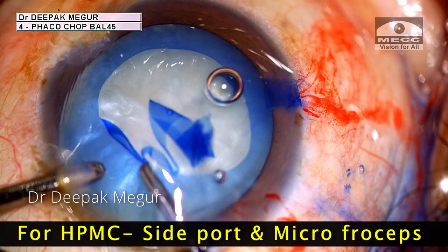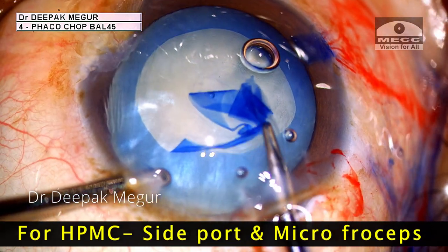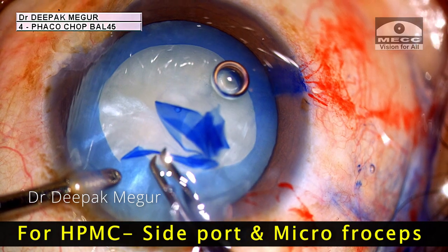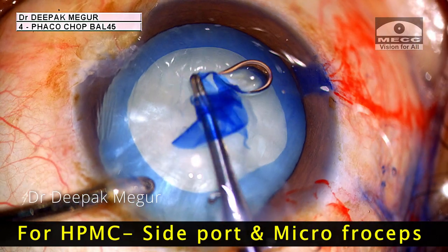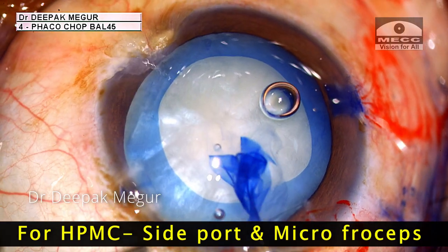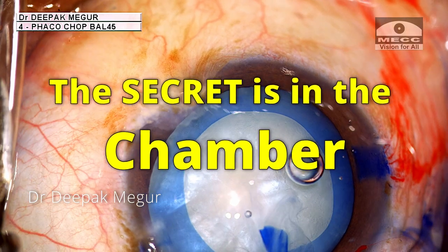If one is using only HPMC, we can achieve this quite successfully by going through the side port, which minimizes the loss of OVD and hence the chamber can be maintained. The bottom line, which I always keep saying: the secret is always in the chamber.